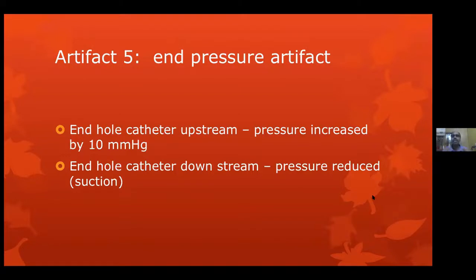End pressure artifact is where there is a pressure energy that is being recorded by the tip of the transducer.